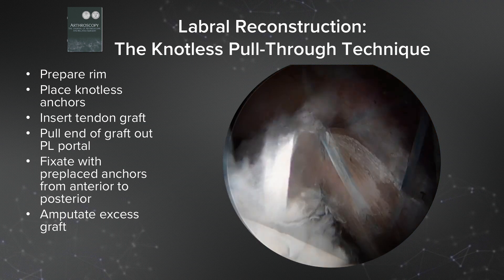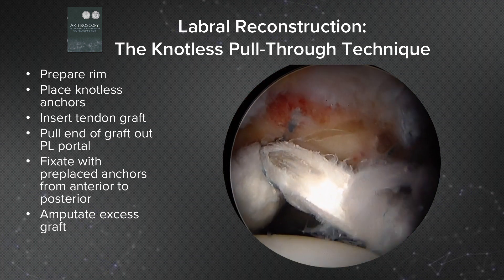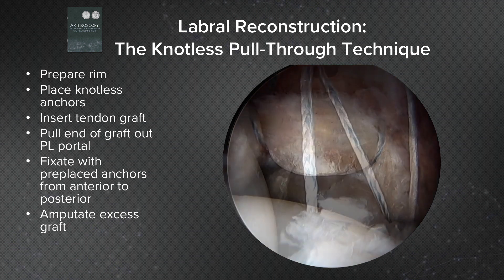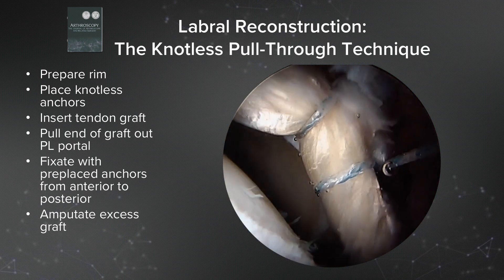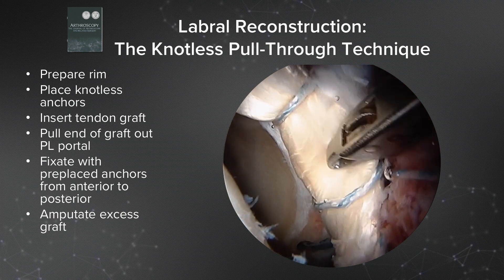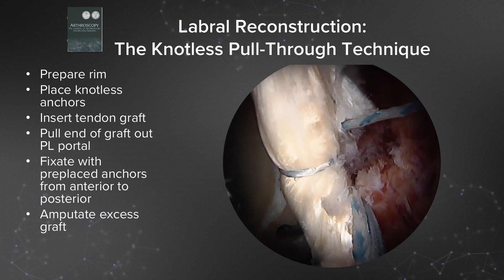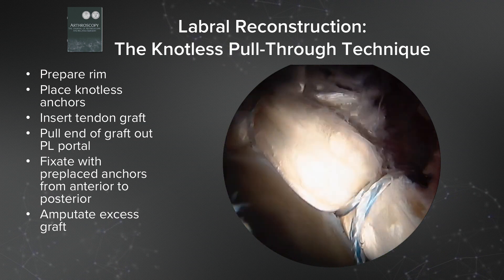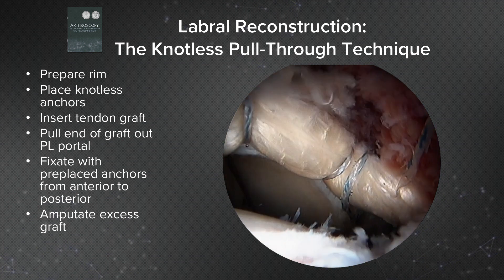We will pass the sutures around the graft and anchor the graft in order from anterior to posterior. These knotless suture tack anchors are very easy to use after placement of the graft — we can simply pass and pull through. Each anchor is loaded in order after the passage of the graft and the passage of the suture around the graft, then tensioned to the desired tension. We're fixating the graft with the pre-placed anchors from anterior to posterior, making sure that we have the appropriate tension on the graft as we go.